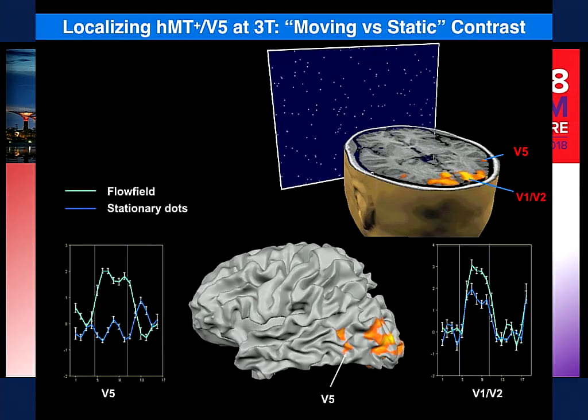And I give you just two examples, one of our lab, one of a lab from Tootell, from Boston. And if you do that, you see here, we have mapped, this is 20 years ago, area MT, which I will focus on now, V5 in the human, by motion stimuli. So just showing at that time, in the 90s, the early days of fMRI, you were happy if you see something moving versus static on 1.5 Tesla actually, not 3T, this was 1.5 Tesla. And you see V5 coming up mainly if the dots move and does not come up when the dots are static. So it's a nice, simple localizer of motion.